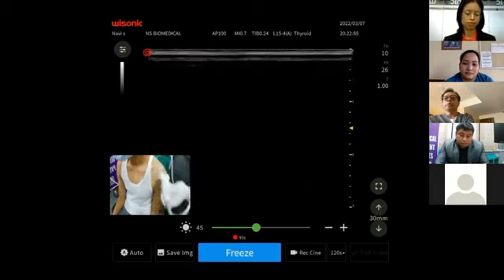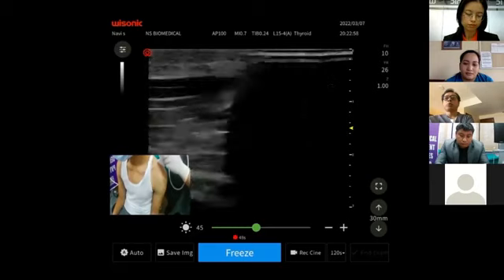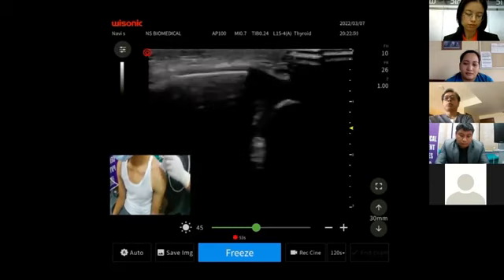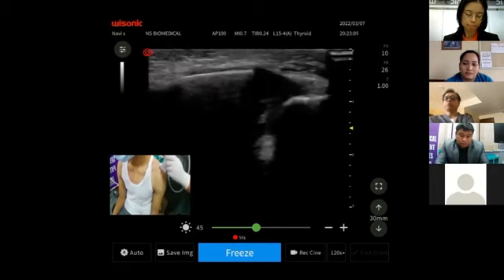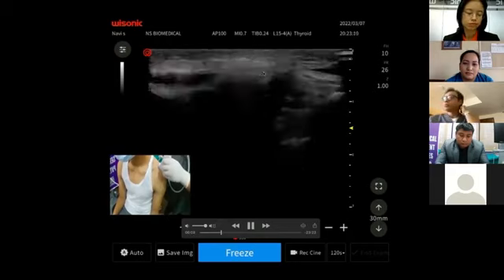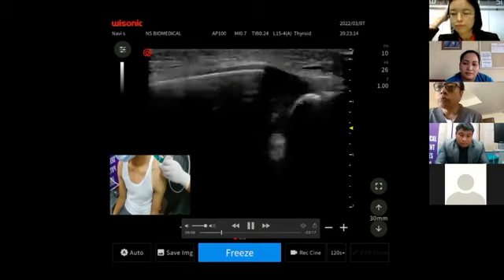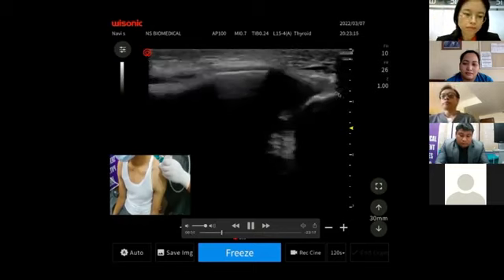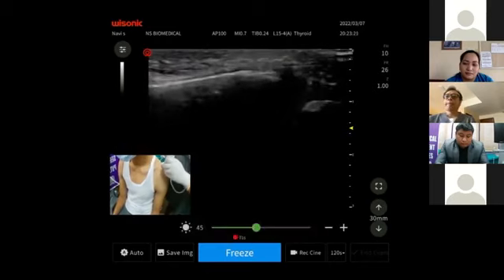So another method is we can always palpate the clavicle, and the most prominent bony structure is the acromion process. And we just drop our probe over it, and we can see the acromioclavicular joint. Again, medially, it's the hyperechoic cortex of the clavicle, which is causing an acoustic shadow. And laterally, it is the acromion process. We can scan the whole of the AC joint superiorly, anteriorly and posteriorly.